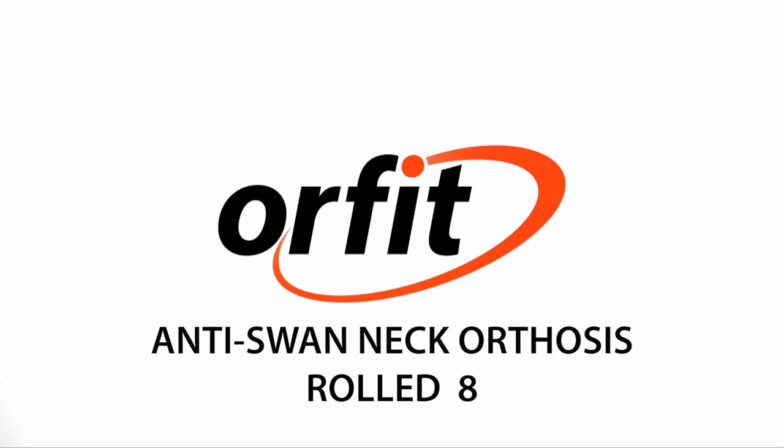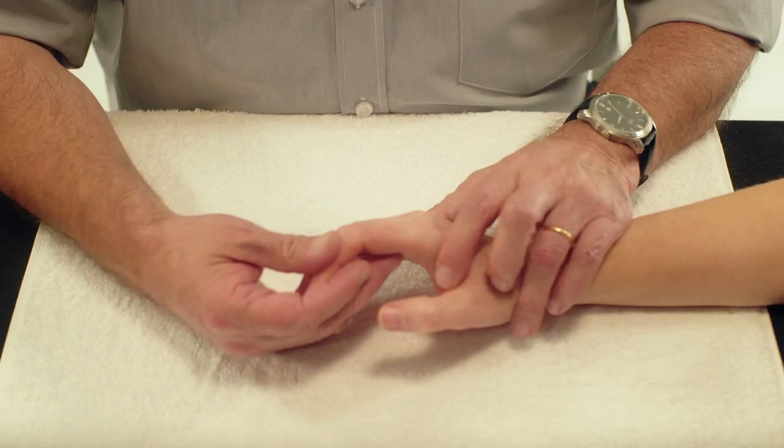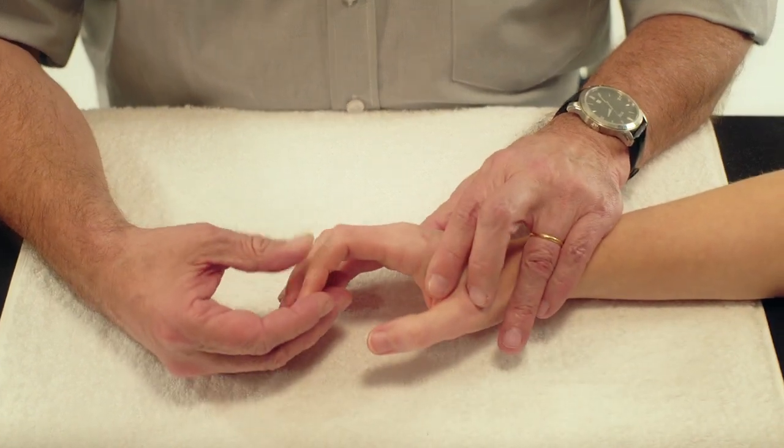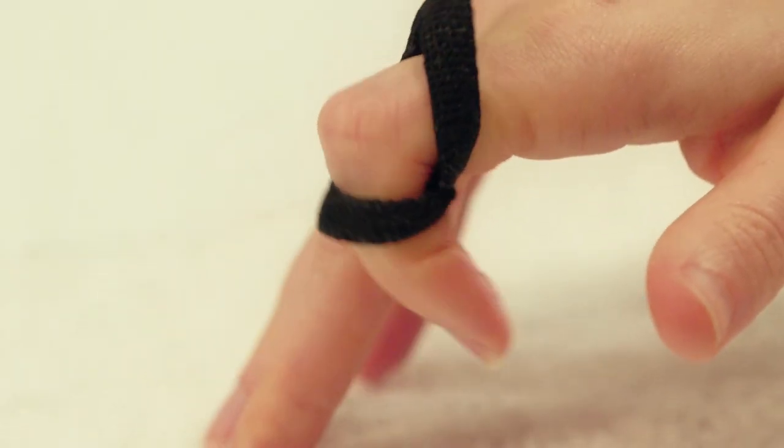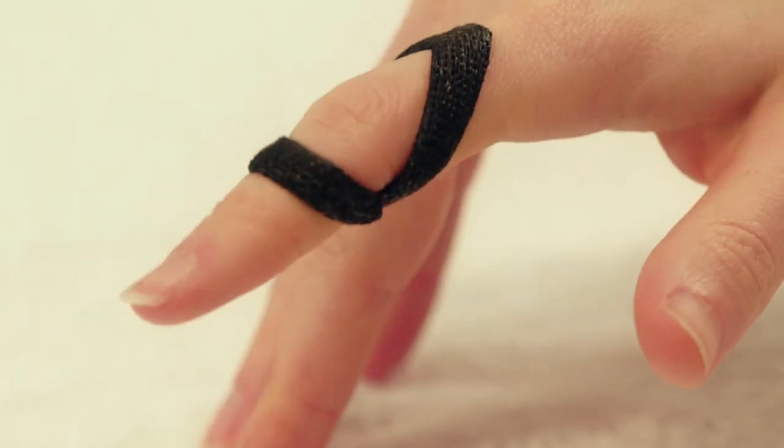Anti-Swan Neck Orthosis. Here we will demonstrate how to fabricate an orthosis to prevent hyperextension of the PIP joint, also known as the swan neck deformity.